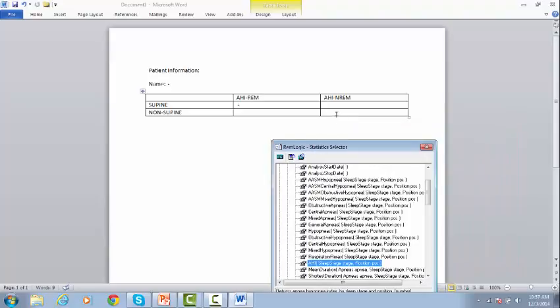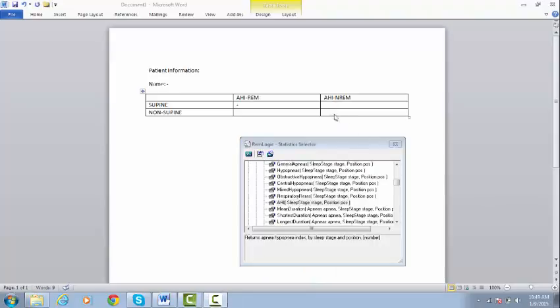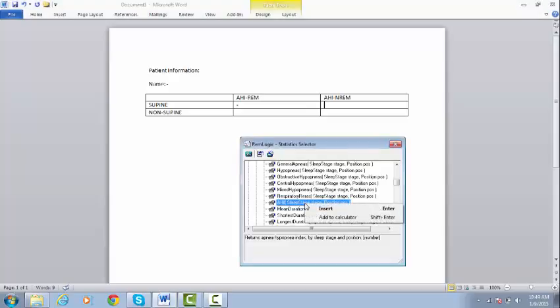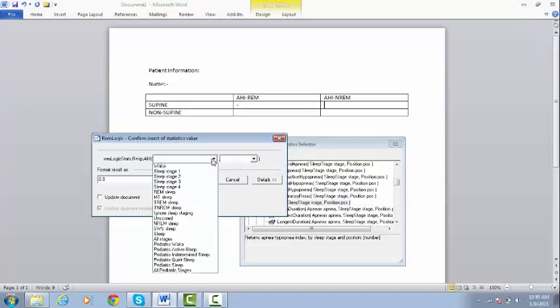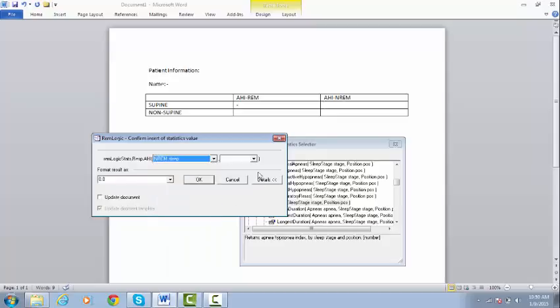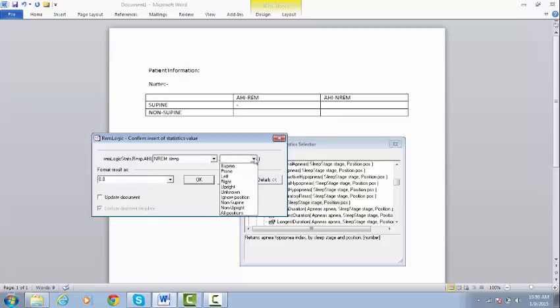To report AHI during Non-Supine, place the cursor in the correct position, right-click on AHI, select Insert, select Non-Supine, and in relation to supine. Click OK.